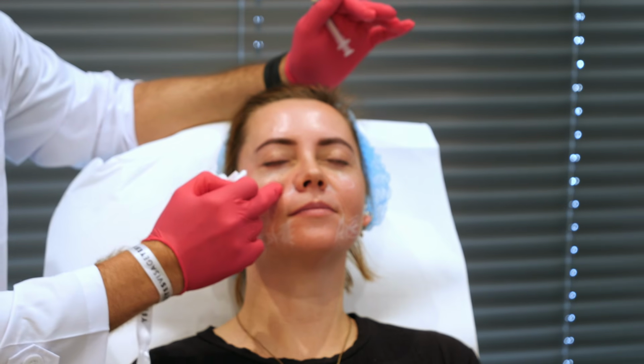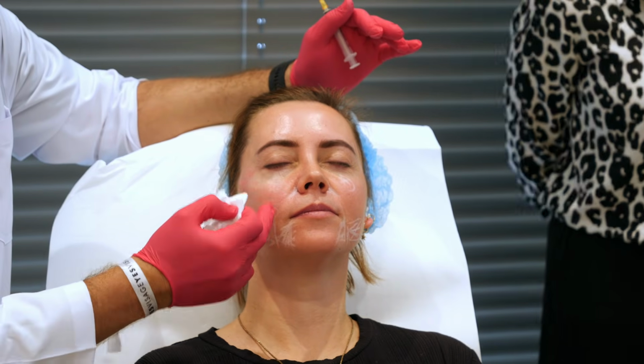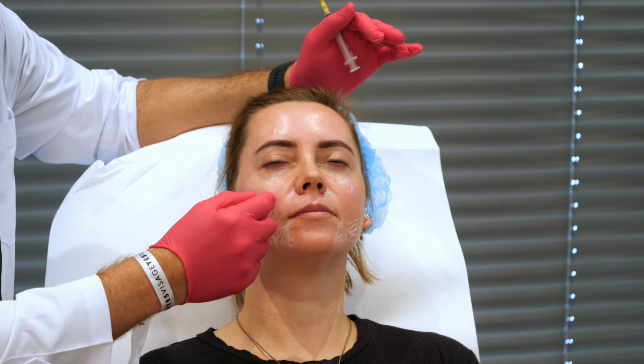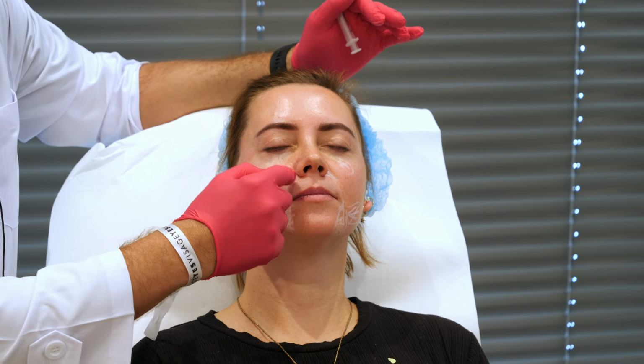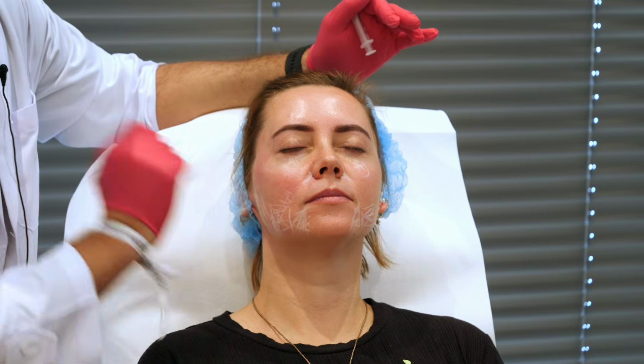The point that we're talking about at first is a loss of volume point, and I will put a little amount of product in the piriform fossa from this one.